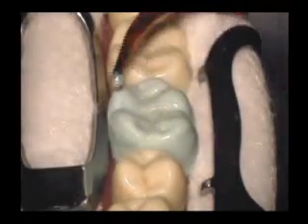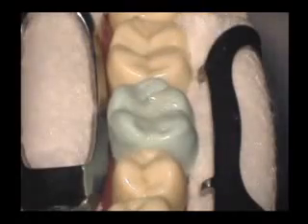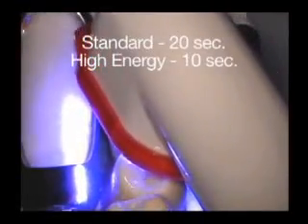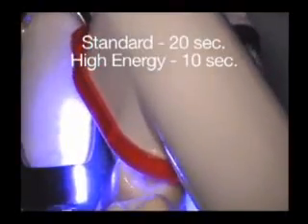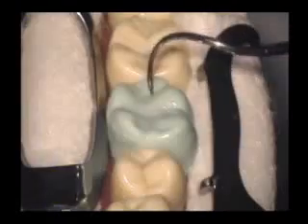Sealant material appears thin when applied for maximum penetration into the pits and fissures. Once in place, it slightly thickens in order to minimize running. Curing of the sealant should occur quickly after placement in order to avoid contamination. Using a standard curing light, cure for 20 seconds. For a high-energy curing light, cure for 10 seconds.